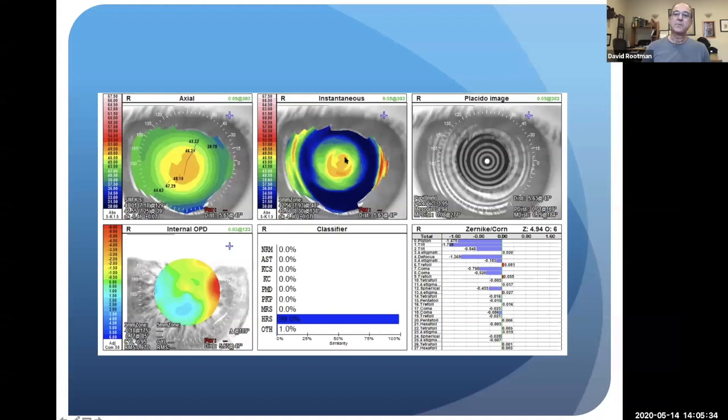With myopic treatment, most of the treatment is in the center. It's like you take a bulldozer and there's a hill, and you go across it with your bulldozer and you flatten it off. Whereas with hyperopia, what you're doing is you're taking a backhoe and you're hoeing out a moat all the way around the center, which leaves this bulging, steep area in the center.